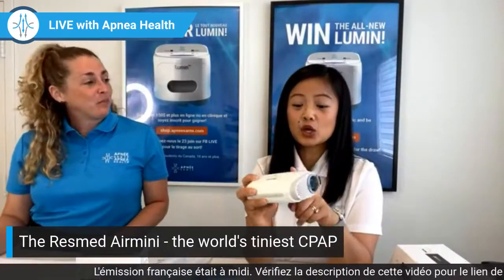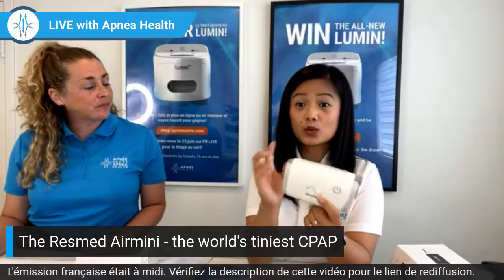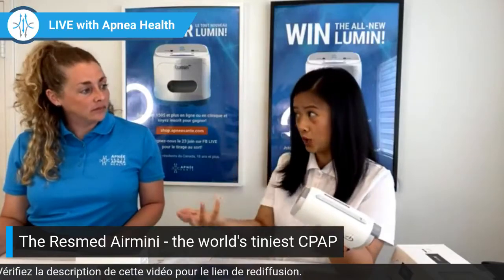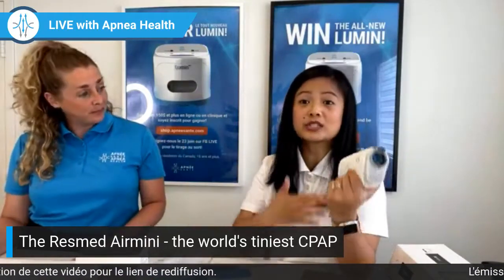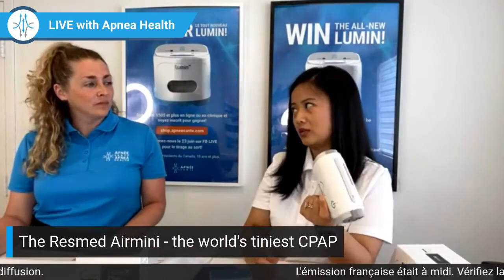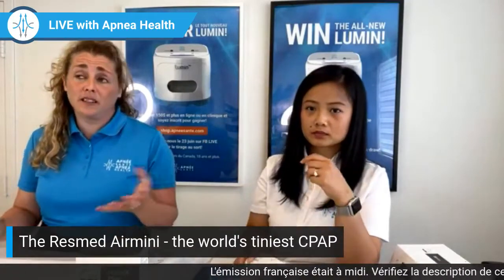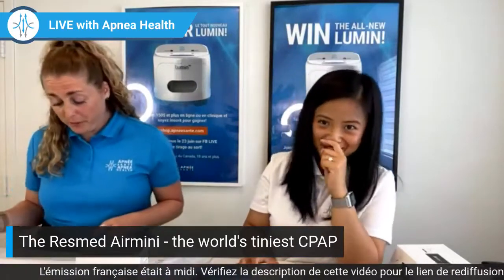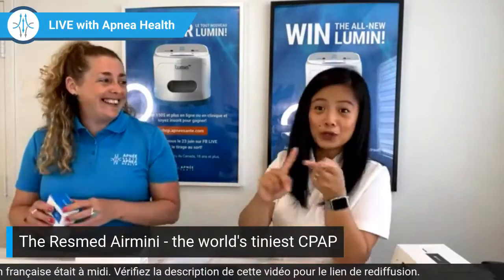And so, like I said, it's safe to use on planes. With the HME filter, you're actually not producing any droplets. Yes, it's so true. So you're not contaminating such an enclosed area. It's actually more sanitary and safe. Oh, that's good. And plus, the good side of not bringing water is you won't spill any in the plane. Don't be the one making a mess.